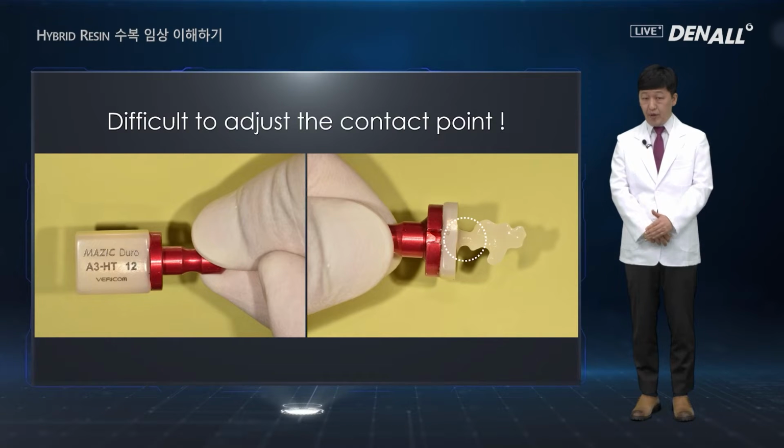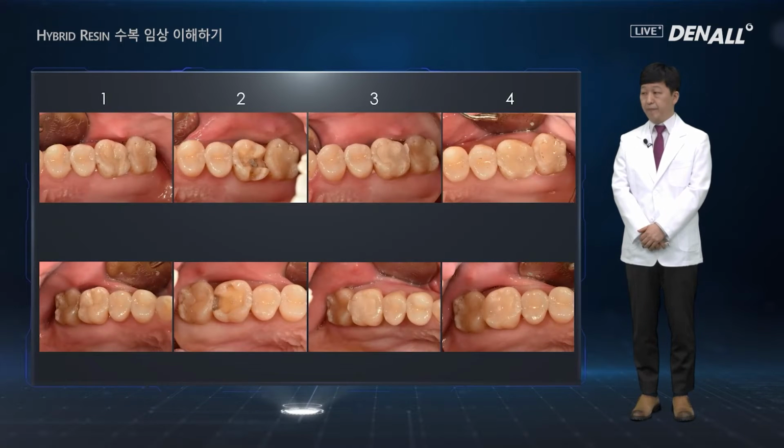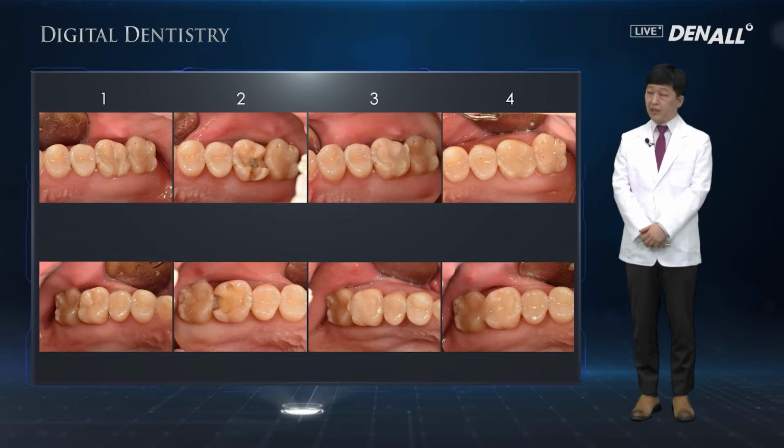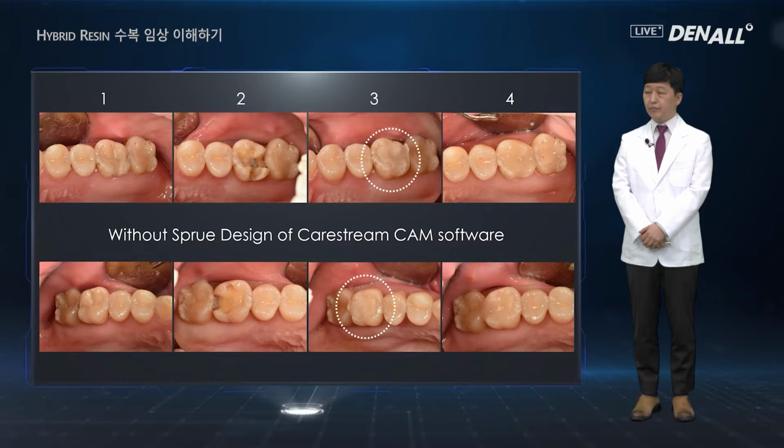If you need to excessively adjust the contact, it will either be under contact adjustment or the contact will become loose. And there's quite a lot of possibility of this problem. In order to prevent the sprue being attached on the contact, the proximal contact area is milled. However, this form is also not quite satisfactory. This is no longer used.